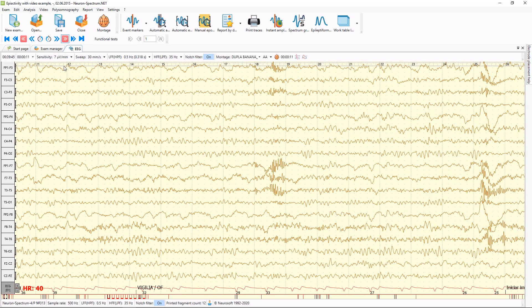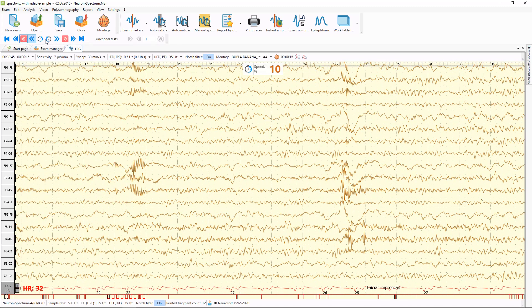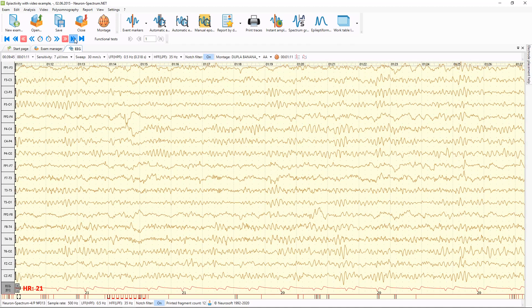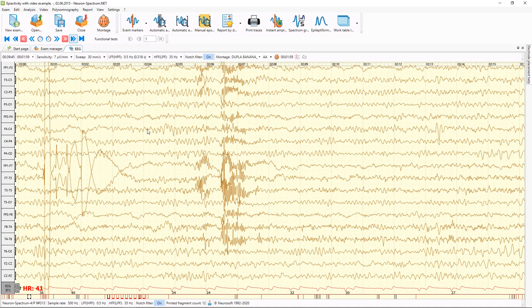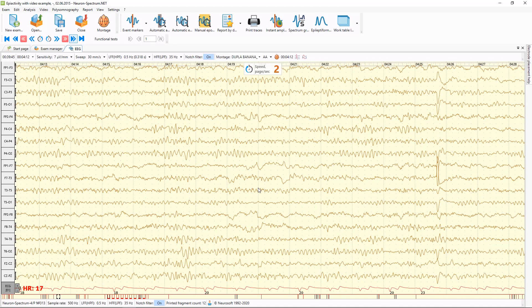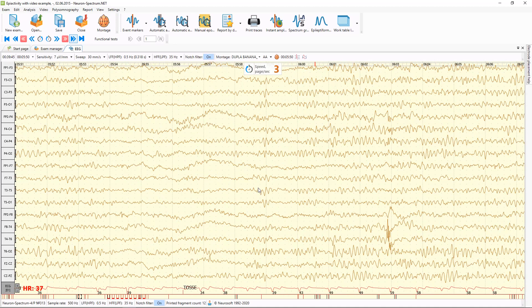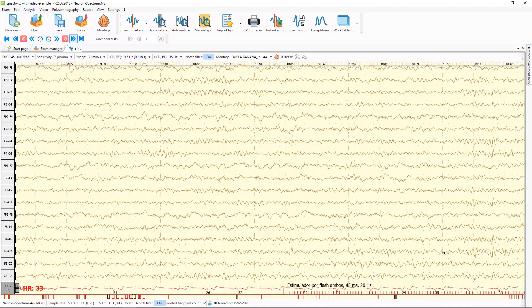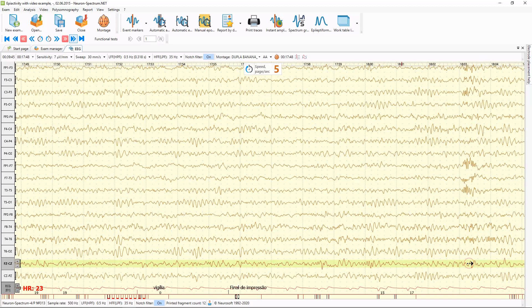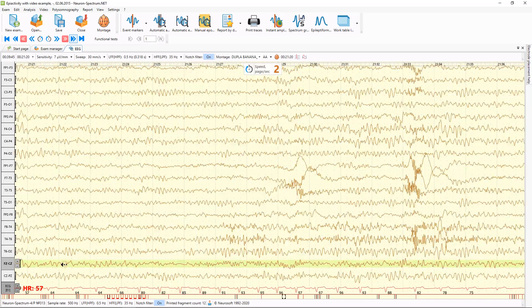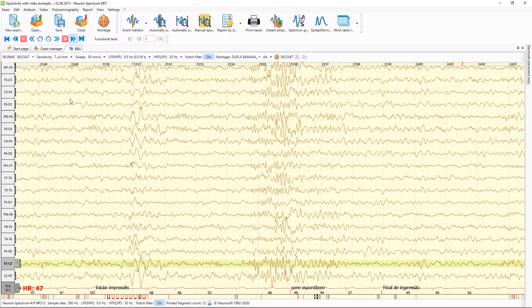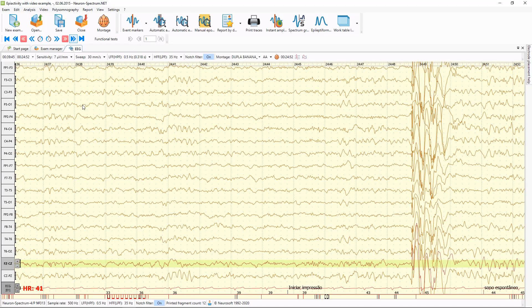For example, automatic move forward or backward, or move page by page. In this mode you can manage the speed of scrolling with your mouse wheel — increasing or decreasing the velocity. You can also press the mouse button in the bottom side of the traces to increase and decrease the velocity of scrolling. To stop scrolling, you can use the Space Bar.